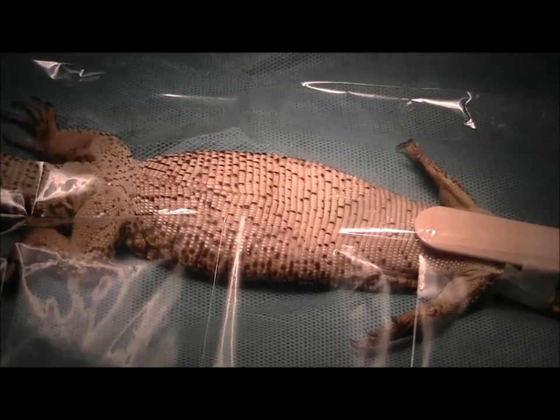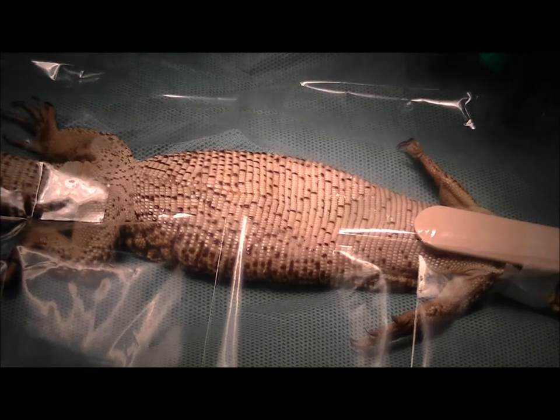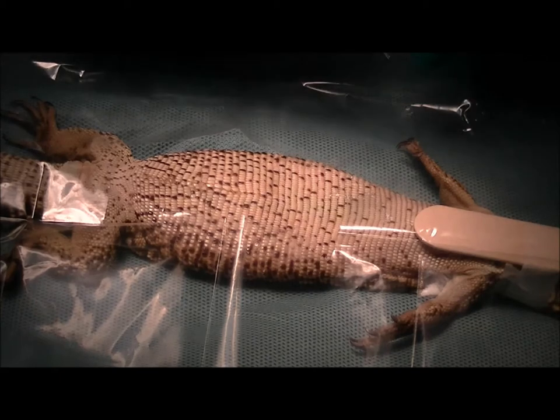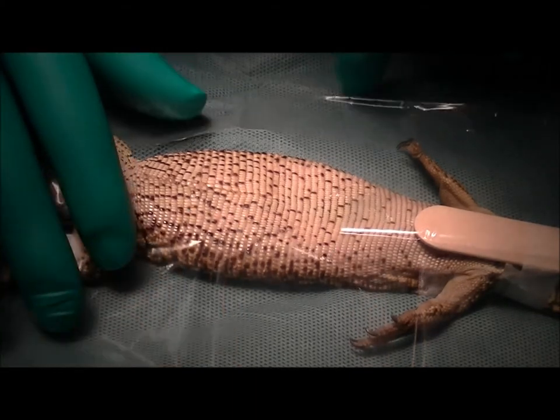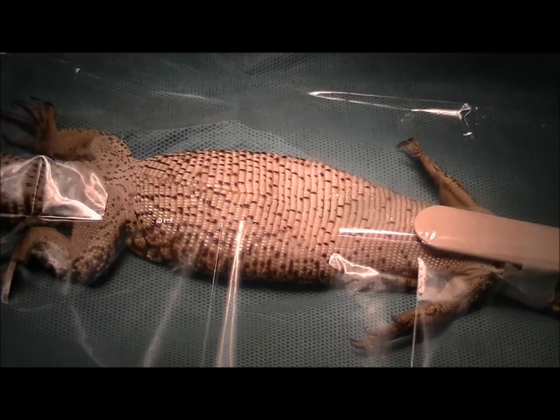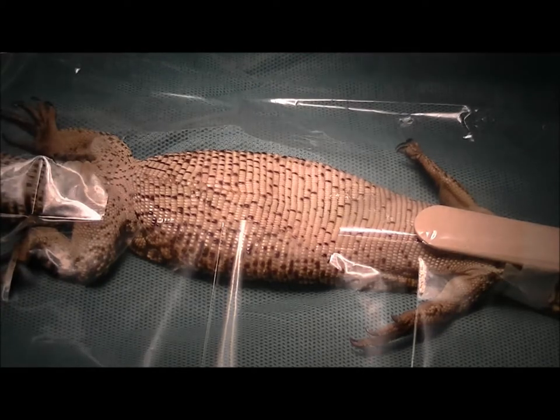We've anesthetized this little monitor and got her prepped up for surgery. She's lying on her back here. We've got sterile clear drapes — we use the clear drapes because it allows us to see the whole animal and check whether she's breathing. We've got her hooked up to the ventilator. Reptiles don't breathe when they're under anesthesia, so we have to ventilate them. You'll hear a soft clicking noise in the background — that's our ventilator, going about one breath every 15 to 20 seconds.